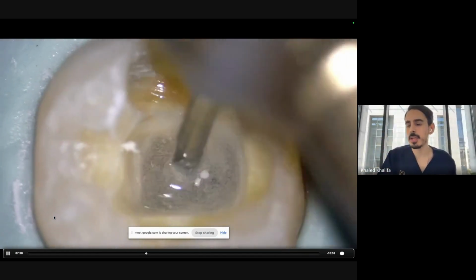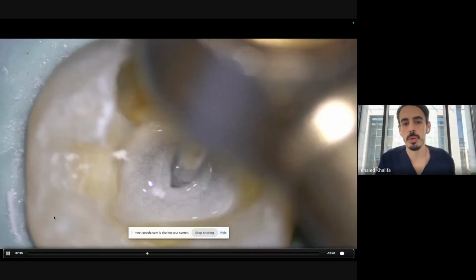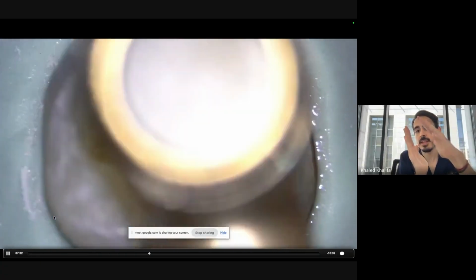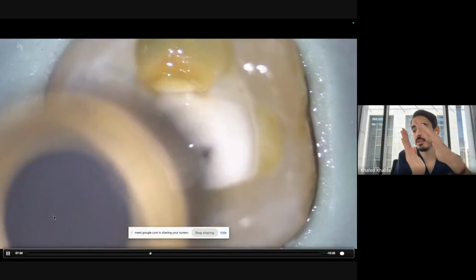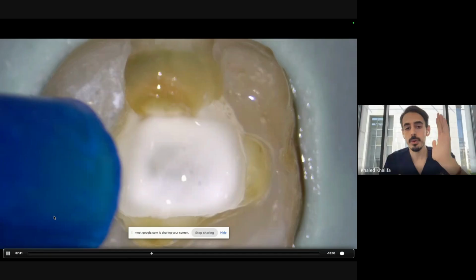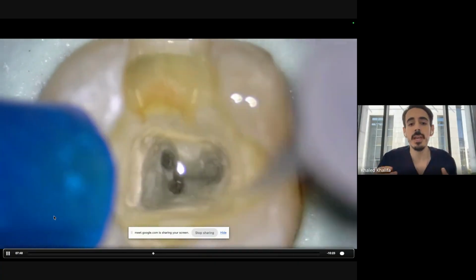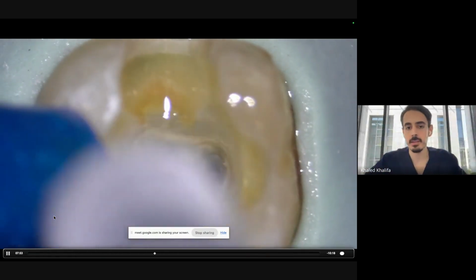Now we're doing the mesiolingual canal, with a brushing action on the mesiolingual wall. It's gonna transform the canal. Look at me from this direction. The canal originally is like this. Then it's gonna be like this. After removing the dentine covering the orifice, the canal is gonna be transformed into a straight line access kind of canal. Now we're gonna do heavy irrigation inside the canal, and after the orifice opener, the picture is gonna be very clear. You're gonna have 3 canals and straight line access.